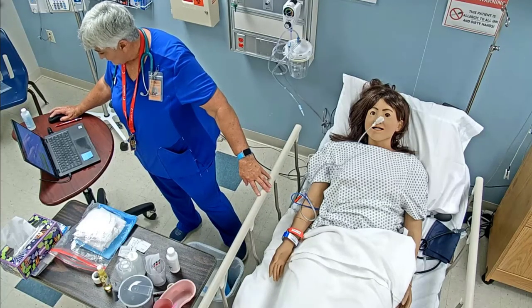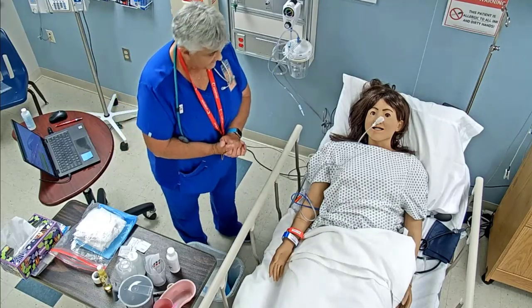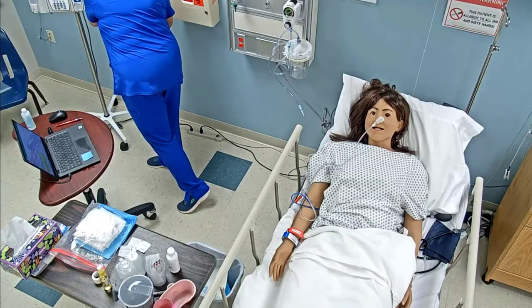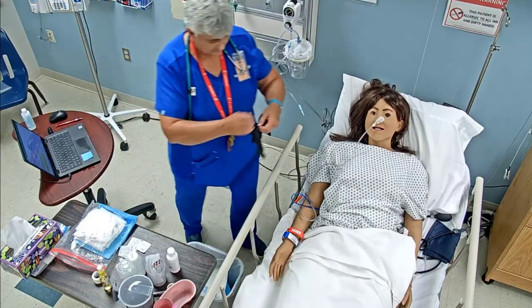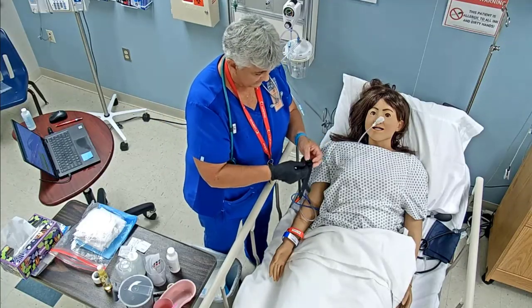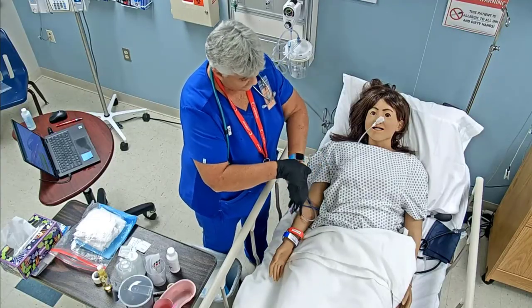Our order says to remove that catheter. All right, so a couple of things I've got to get ready. So I'm going to go ahead and put some gloves on. Now, are you in any kind of pain? On a scale of 0 to 10, 10 being the most pain you've ever had and 0 being no pain, what would you consider it? A 0 right now? Okay.